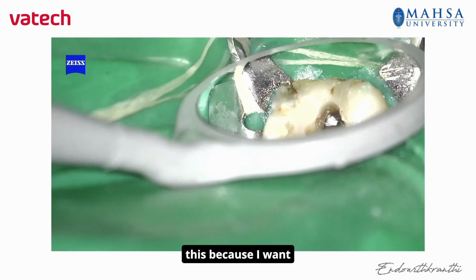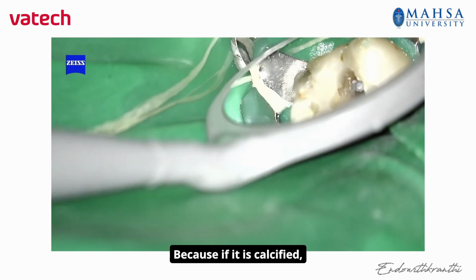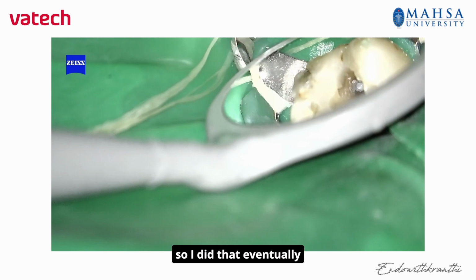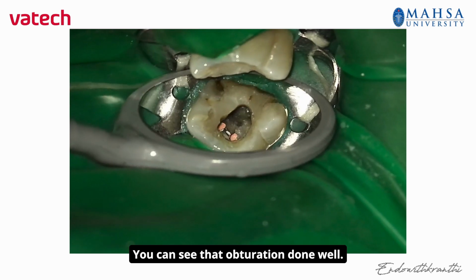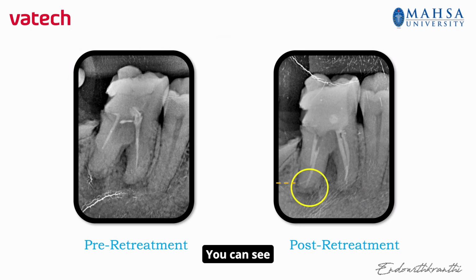Why did I do this? Because I want my sealer to reach as much as it can reach, because if it is calcified, gutta-percha may not reach into the tiny portion. So I did that. Eventually, because I did that, this is obturation. You can see that obturation done well. You can see there lateral extrusion of my sealer.